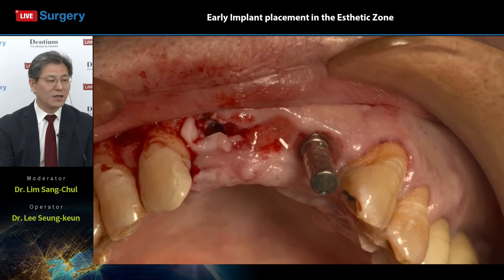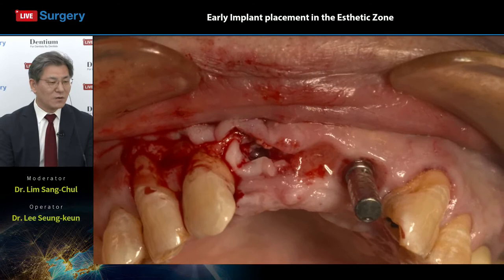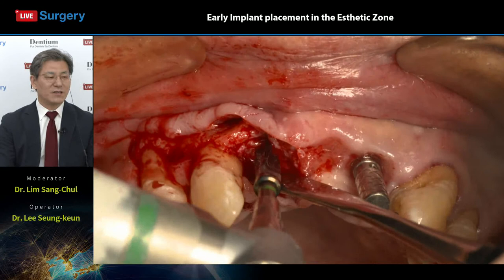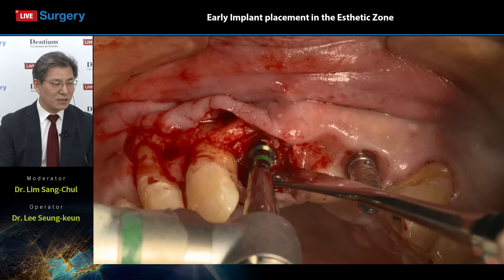Number 21 implant was a cement retained single implant restoration. Already this 21 implant is installed at this site. So Dr. Li is checking the parallel with the neighbor implant. The already installed number 21 has this kind of direction. This direction is good for the cementation type of final restoration. But anyway, Dr. Li is checking the path with the already installed neighbor implant fixture and making a drill, right?